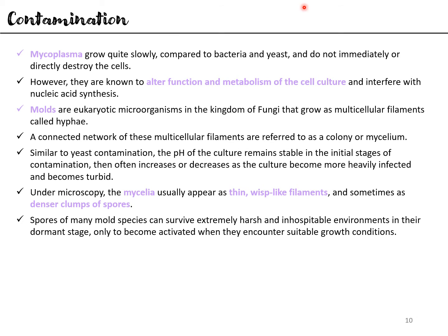Spores of many mold species can survive extremely harsh and inhospitable environments in their dormant stage, only to become activated when they encounter suitable growing conditions. And this is the problem with all contaminants. You might think that they're dead, but no, they're just dormant, and they get the appropriate condition and bam, they begin to grow.